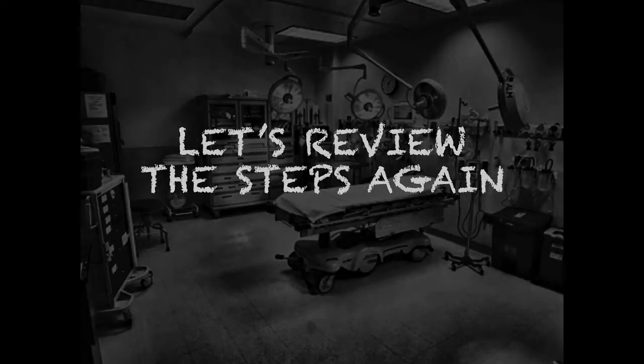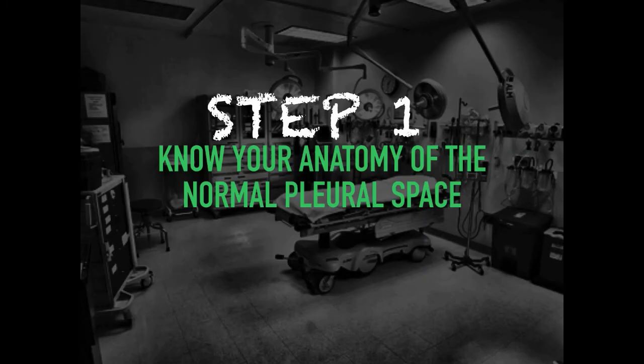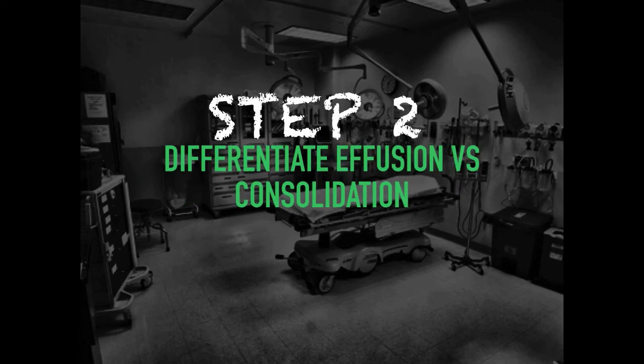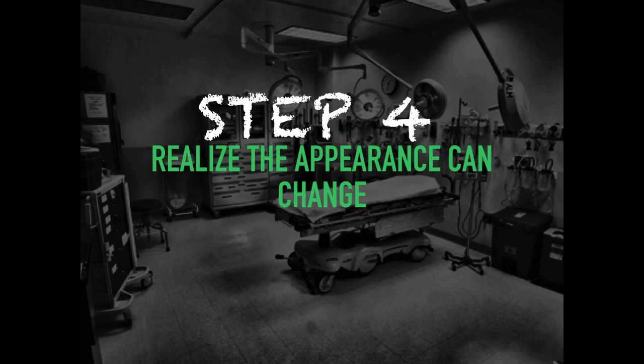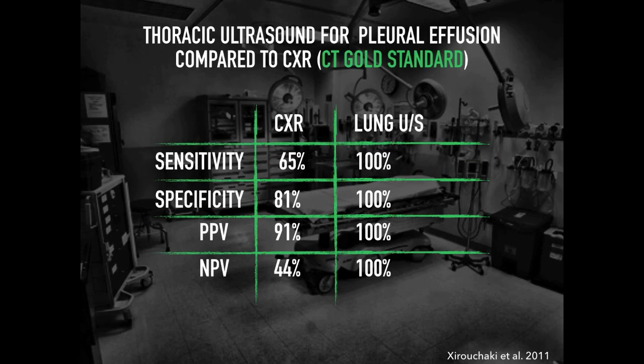So let's review those steps. Know your anatomy. Again, I cannot stress this enough. Differentiate effusions from consolidation, make sure that the anechoic space is indeed above the diaphragm, and realize this appearance can change from anechoic to hypoechoic to more heterogeneous. Finally, you should know that thoracic ultrasound performs more like CT than X-ray. As we can see here, it demonstrates 100% sensitivity and 100% specificity. But this requires practice and due diligence, as we've discussed.